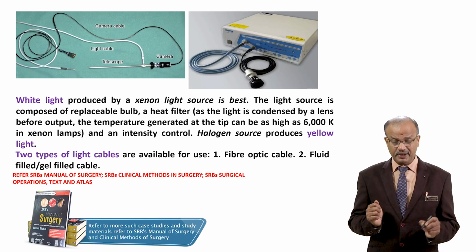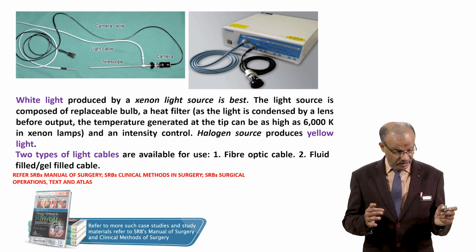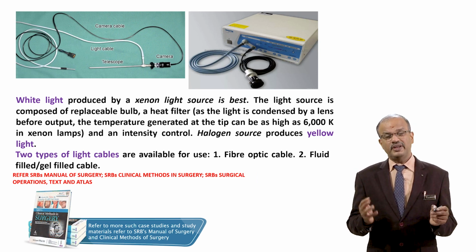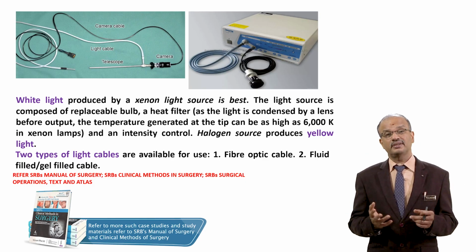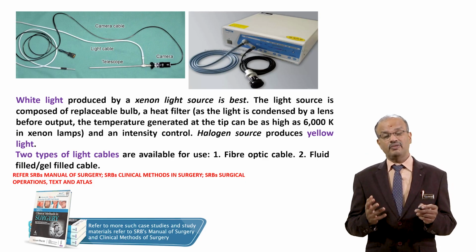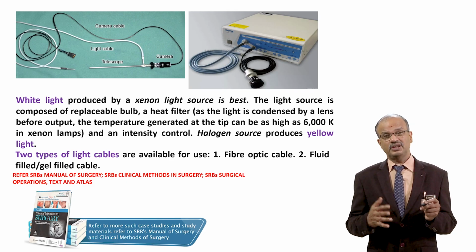There are two types of light cables: fiber optic, which is the one commonly used, and fluid gel or gel fluid filled cable. The gel cable is cheaper, but the brightness is not there. Whereas fiber optic is beautiful, but maintenance is difficult. It is costly.